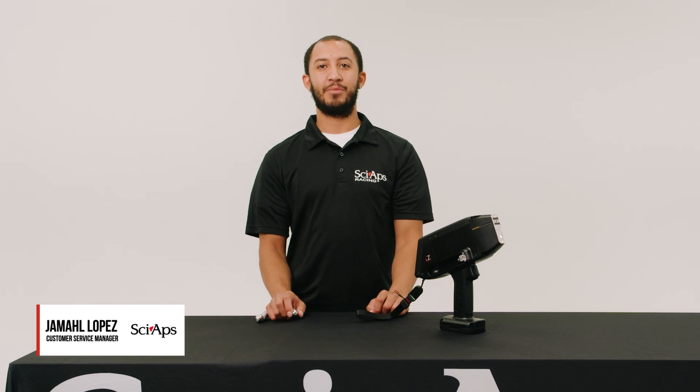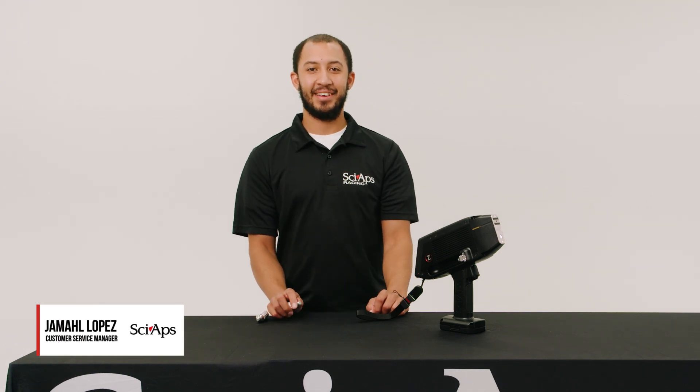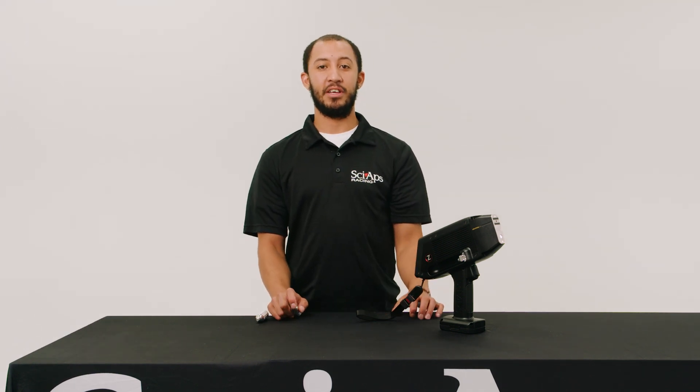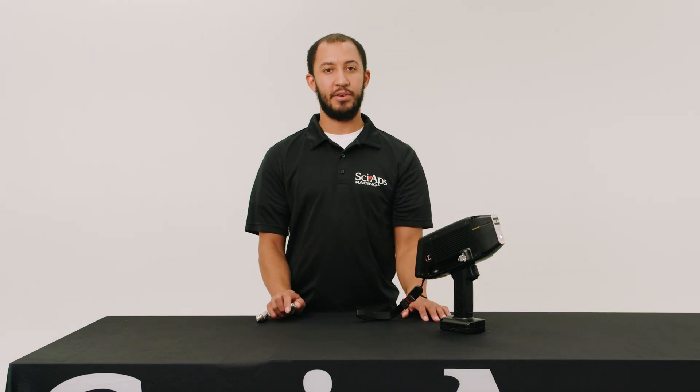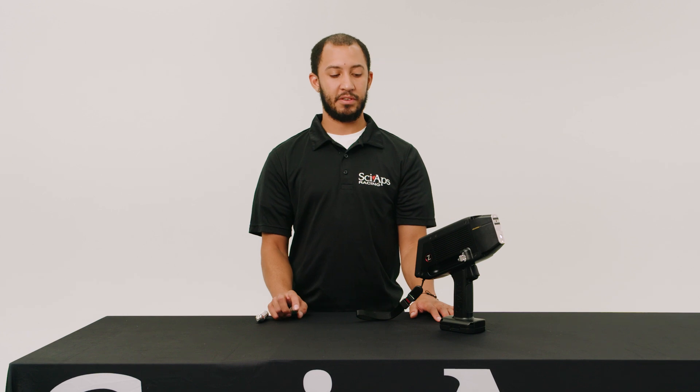Hi, my name is Jamal Lopez and I'm the customer service manager over at SciApps. Today we'll be going over how to insert an argon canister and also unscrew one and take it out of the unit itself for our Z9 series.